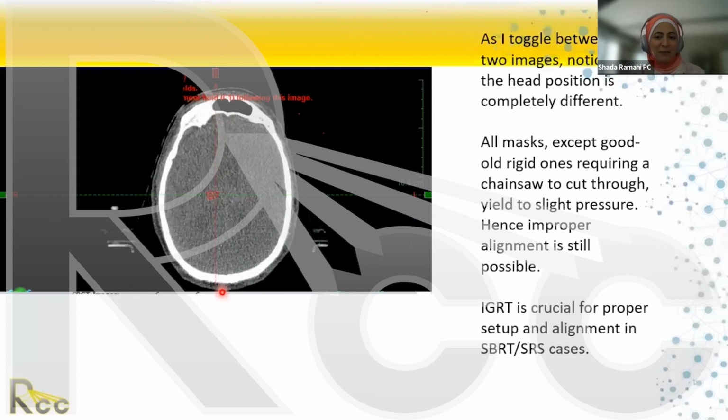So you can imagine, right? SRS cranial setup can be easy if everything is aligned well and you reproduce the alignment on your Linac. If whatever comes from the CT sim is crooked, and you have to reproduce the crookedness, you're going to spend at least an hour trying to align the patient. So the root of the problem is CT simulation. You really do need a very experienced CT sim therapist with enough time to do a proper job and proper alignment.